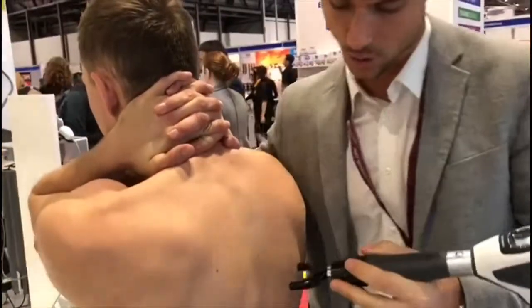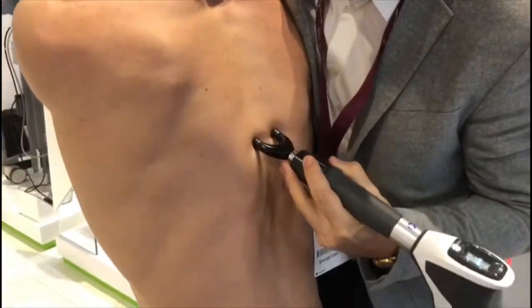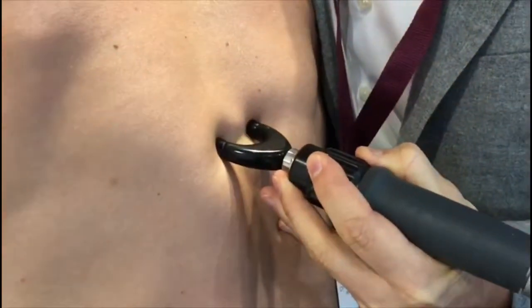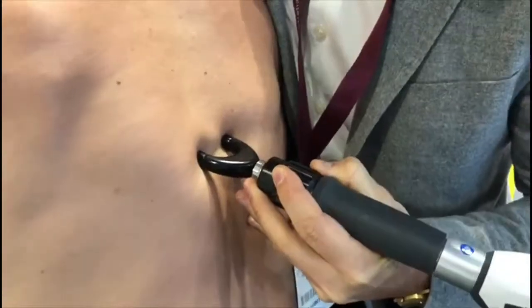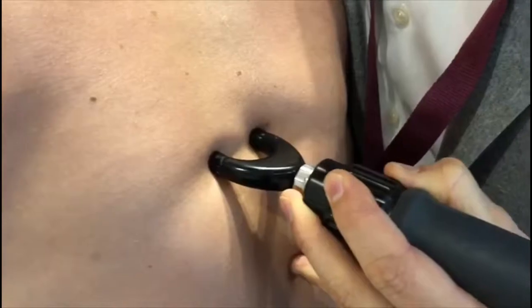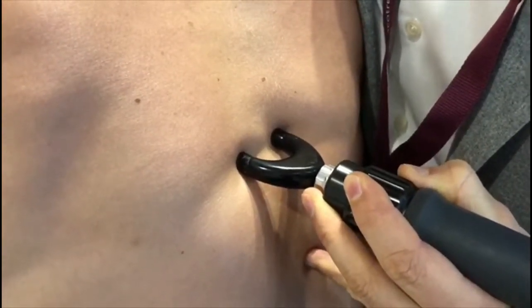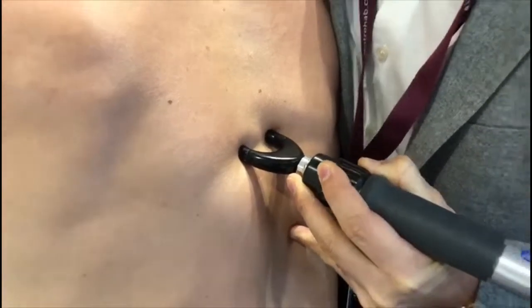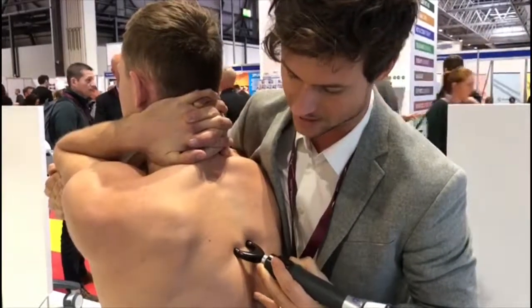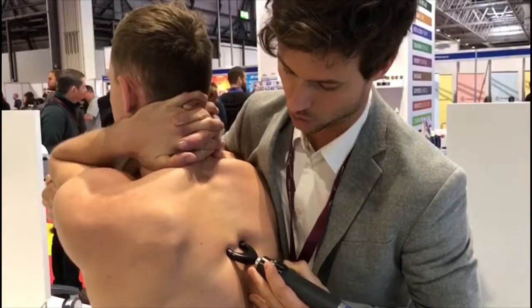And then I will try to fixate the region, just like that. So I will palpate with this — now I want a joint. And I will just stay there. Feels okay? Yeah, good. Some hits like that, then we'll see. There's another joint. I will try to maximize the movement in this region. So this is in an extension position. You have to try to get the right angle, which is approximately 60 degrees to the joint, to get the joint moving.